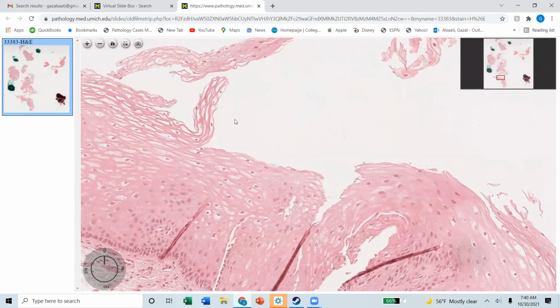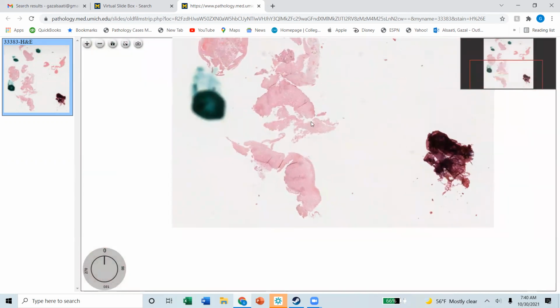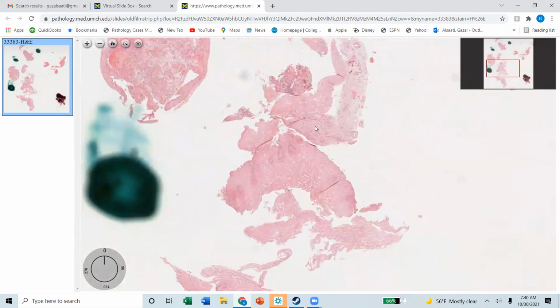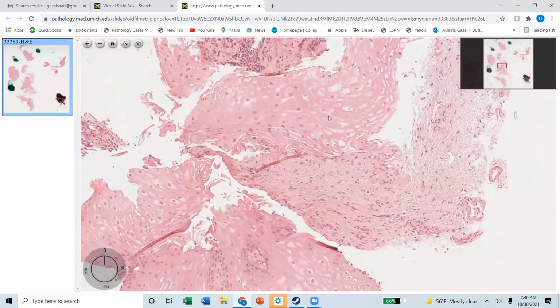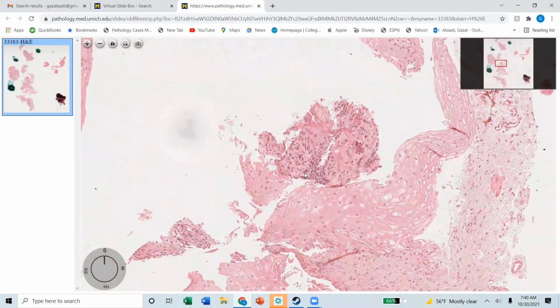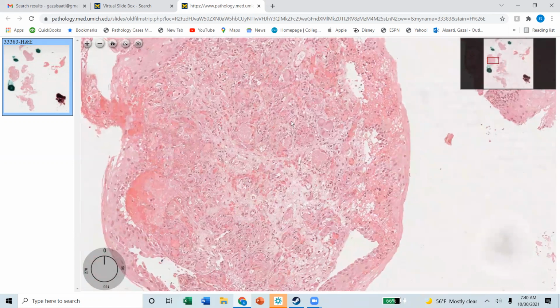This sloughing here is not sloughing esophagitis. This is the normal, okay? And it is nicely maturing and you have nuclei all over the place. So this is a normal portion. Let's go here. More submucosa and epithelium. And now I have a big granulation tissue. See that? Lots of small vessels, granulation tissue, surface epithelium healed with an ulcer.